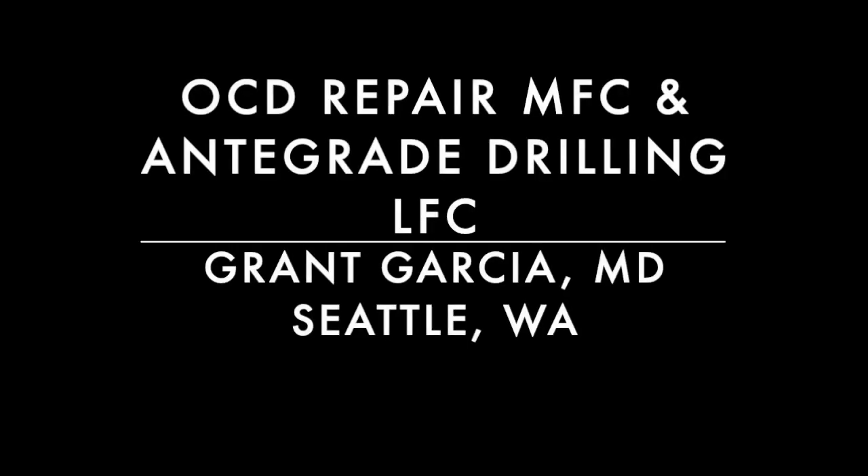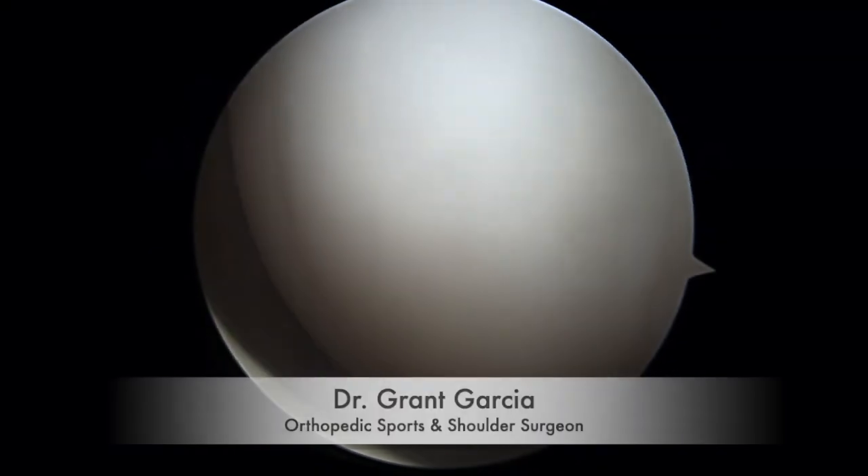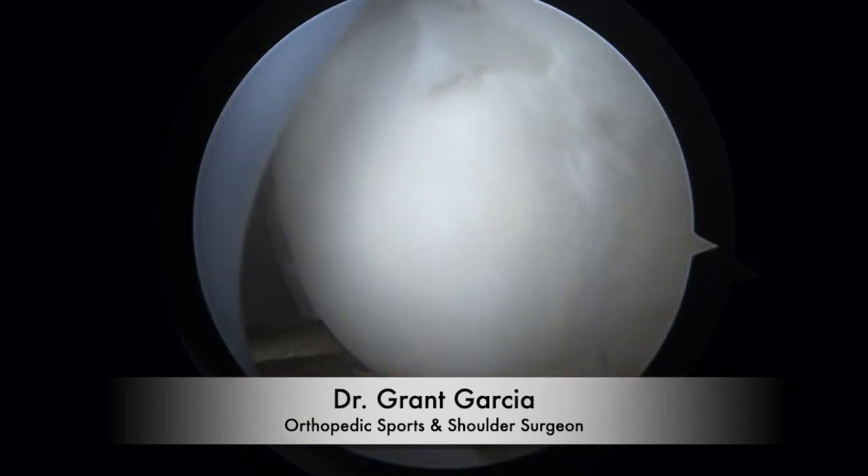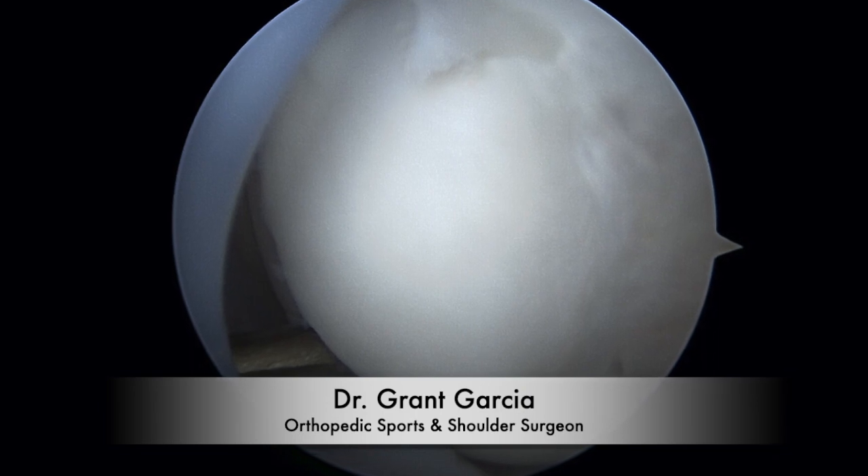We're going to demonstrate OCD repair of the medial femoral condyle as well as antegrade drilling. You can see here the medial femoral condyle and the OCD lesion that was unstable.